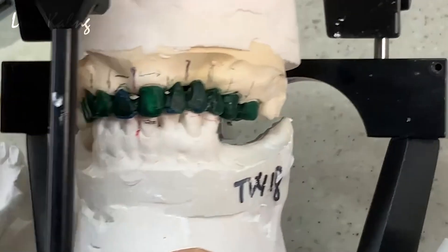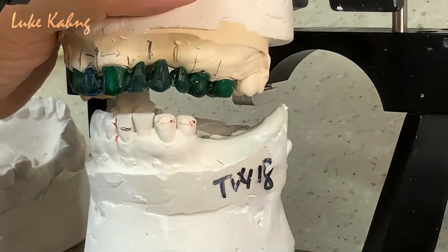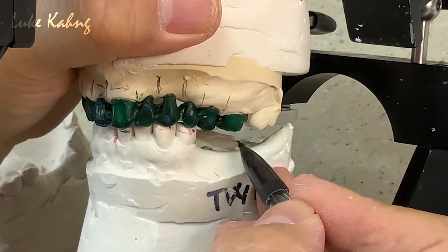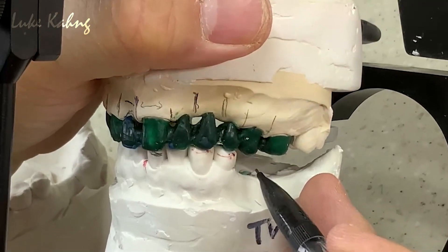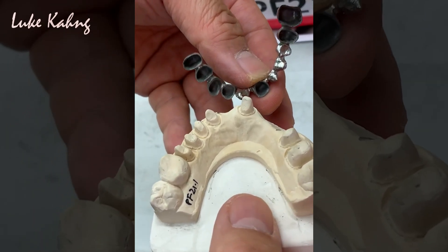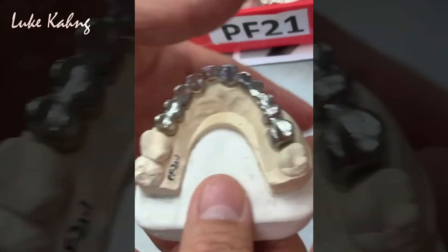If I open the vertical dimension, they can put some acrylic or temporary to maintain — but only one contact. Think about it: all eleven contact points. I have to make it as thin as possible in this area because of adjacent partial or implant. I cannot make it higher here — make it thin — then I can achieve a good occlusion scheme. After we cast the metal and fit it all together.